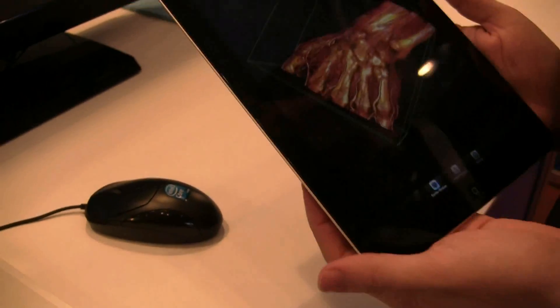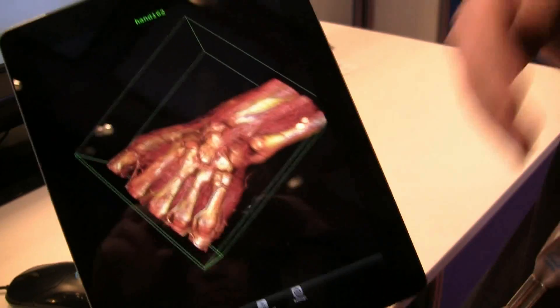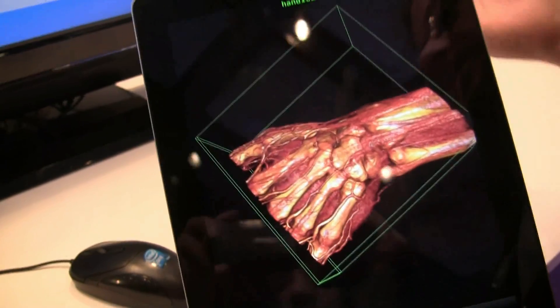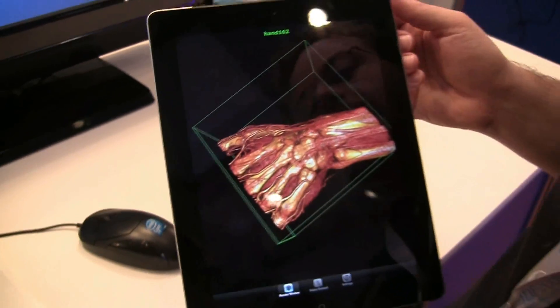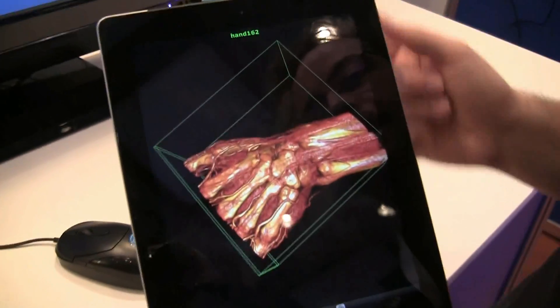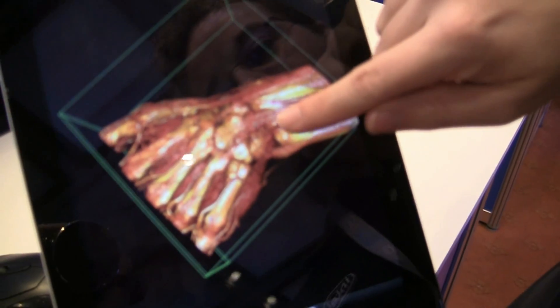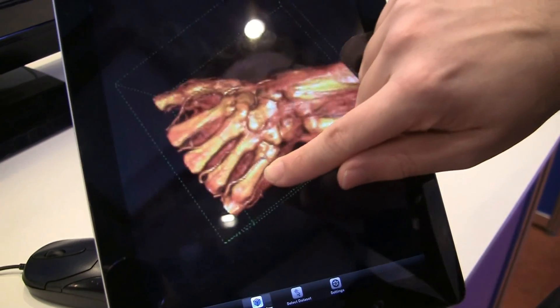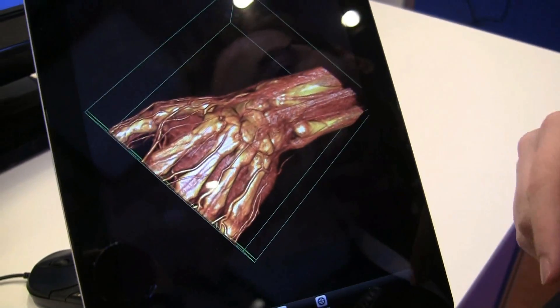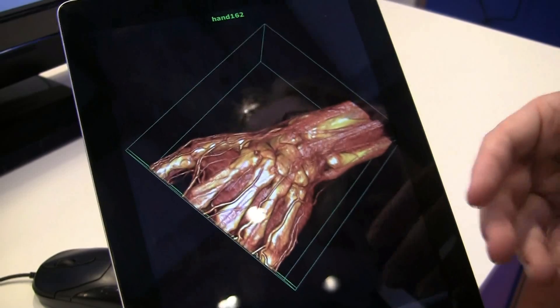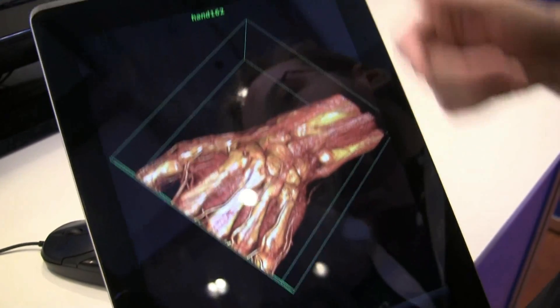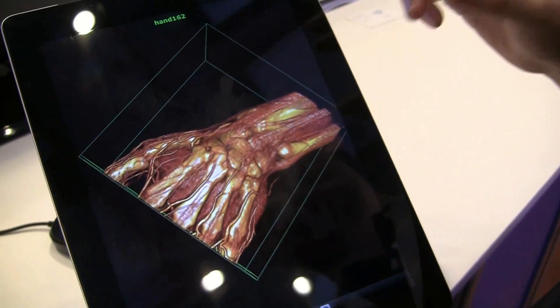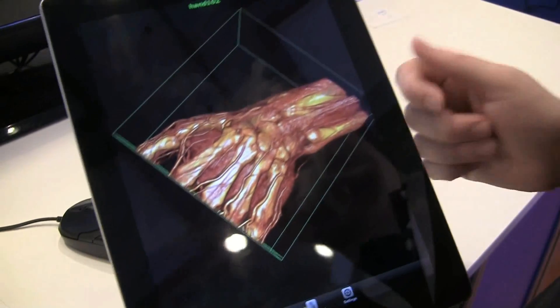Now imagine you're in a hospital situation where the doctor wants to go up to the patient and speak with him about whatever's happening, like if there are any issues with the hand. It's much nicer if they can do that on a tablet. We also have a hybrid rendering approach. Hybrid means that if we interactively move around, you will notice the quality gets lower — we render it locally on the tablet. But as soon as we release our finger again, the quality gets much better, and this picture actually comes from the cloud. We have another machine in this room which does these very high quality calculations, and it streams it over a wireless network to this tablet and displays it here.